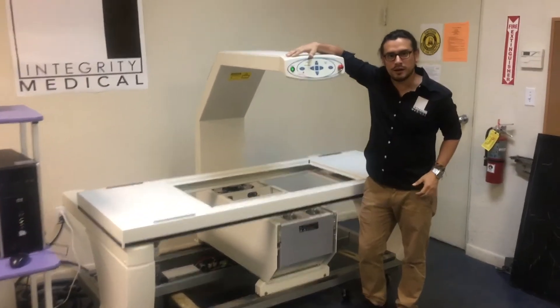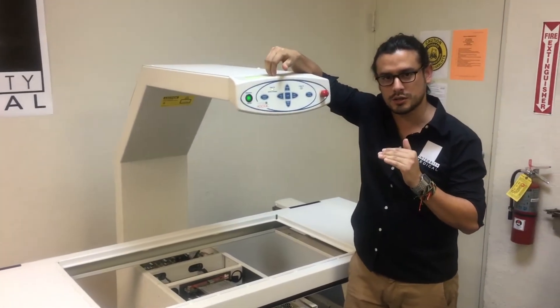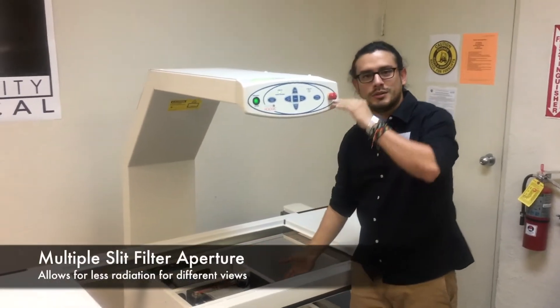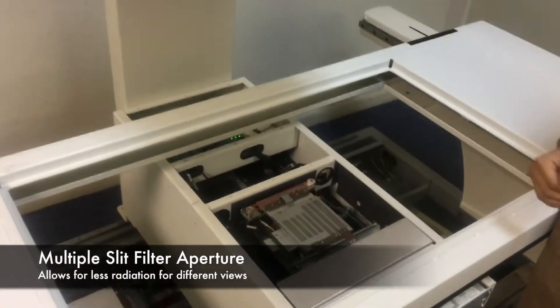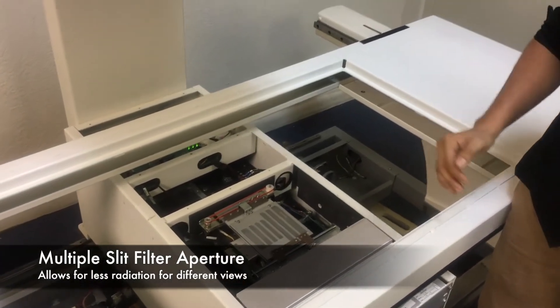As you can see, this is a Delphi. It has been upgraded to a Discovery by Hologic. One of the benefits of this machine is it has a multiple slit filter trunk. The benefit is it will emit less radiation for a different anatomical view of the patients.